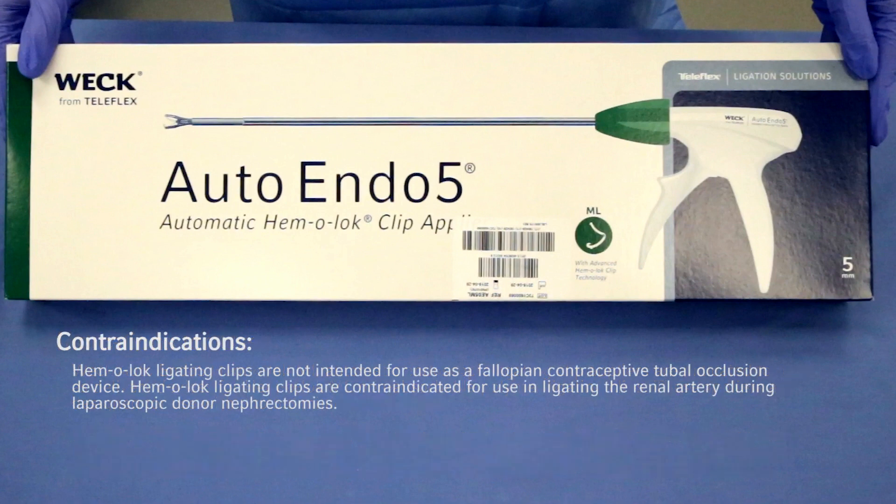Contraindications: Hemolock ligating clips are not intended for use as a fallopian contraceptive tubal occlusion device. Hemolock ligating clips are contraindicated for use in ligating the renal artery during laparoscopic donor nephrectomies.